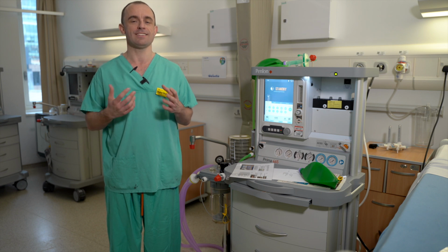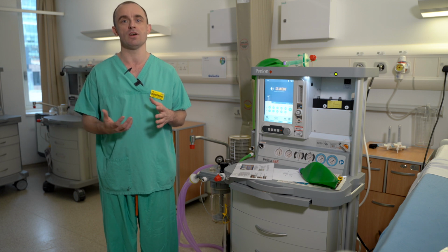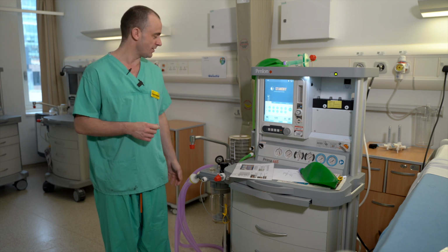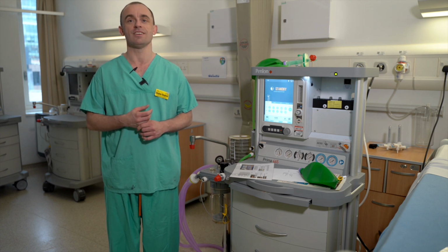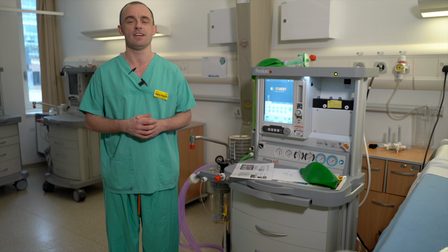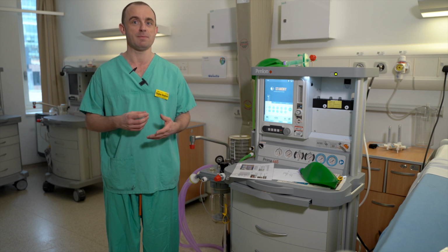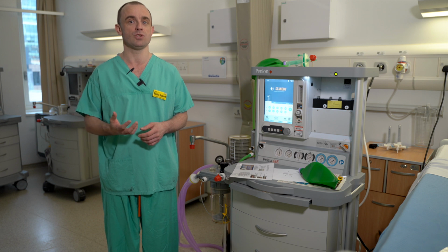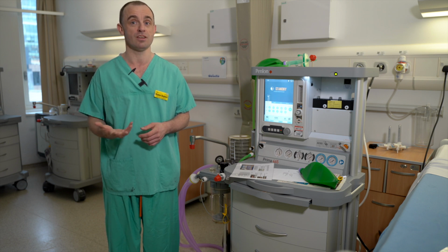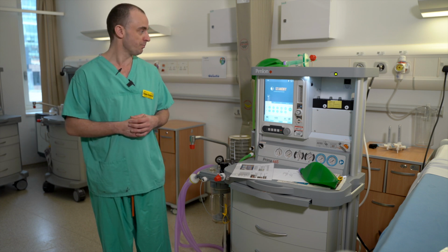Now, an anaesthetic machine has this because it's often a more efficient way of using gases if you're using what's called a circle system. We're not using that in intensive care, so essentially we have to blend those gases in order to be sure that we're getting the right FiO2. So just because you dial up a concentration doesn't necessarily mean that's what you're going to get, and hence it's important to keep an eye on what the FiO2 value that's measured within the circuit is in order to be sure of what FiO2 you're administering the patient.